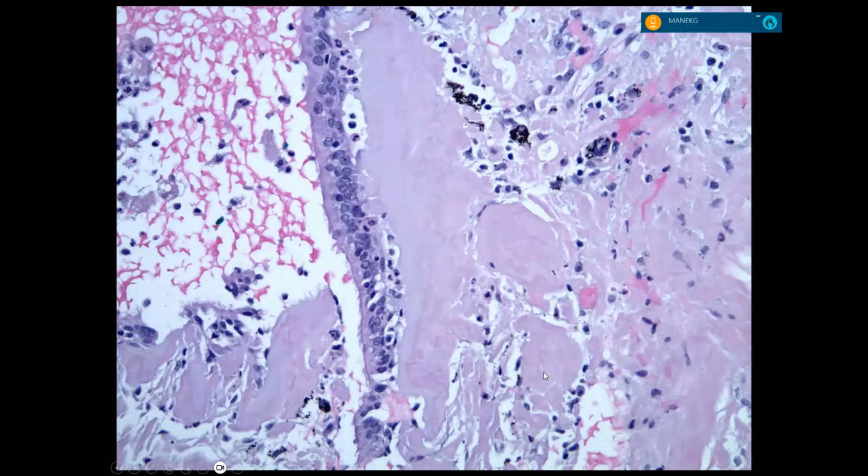I don't have any fibrosis to compare with here, but if you had both, I could show you how it's different. It's a very subtle difference. And because it's difficult, that's why you need a stain. That's why you need the Congo red to prove that it's amyloid.